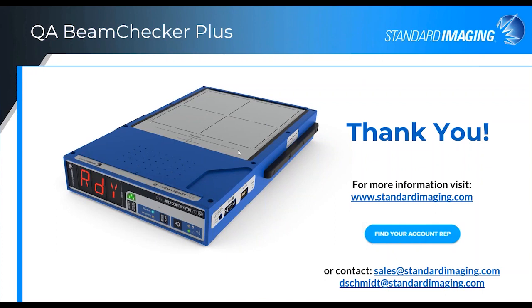But for a full-blown radiation field, light field measurement, we feel that things as simple as the film pinprick tool or something like that is probably more accurate and is a better option for you.